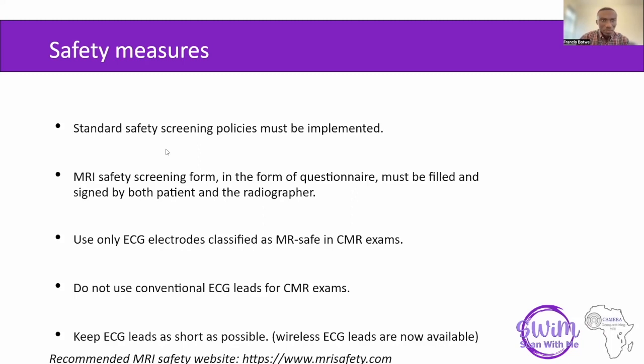So let's look at safety measures in our MRI environment. I think each department should have standard safety screening policies, and these must be implemented because of the dangers in the magnetic field. We all saw some of the dangers that we can encounter in there.